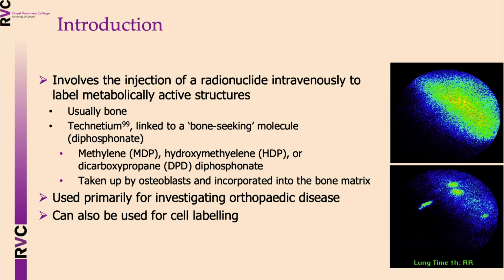There are a number of these diphosphonates that can be used, but we use methylene diphosphonate.